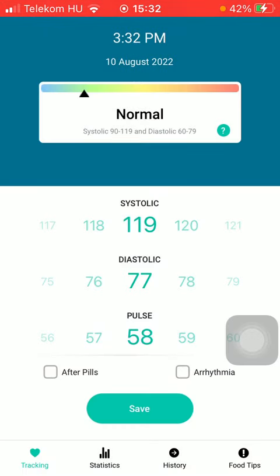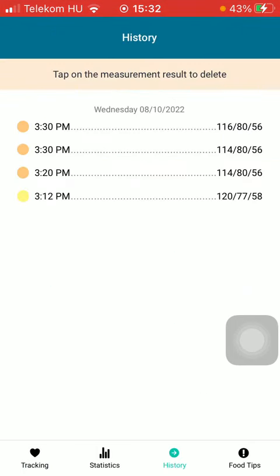Then choose History down below, which is the third option. Here you can see your measurement results.